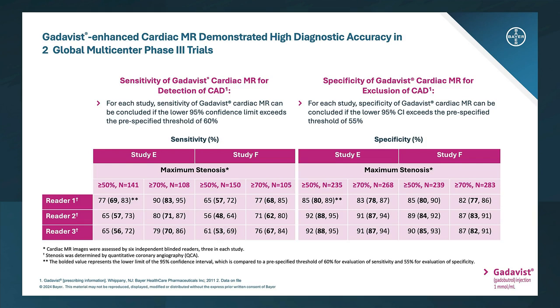The left ventricular myocardium was divided into 6 regions. Interpretations were provided per region for cardiac MRI, reporting presence or absence of perfusion defect and/or LGE, while QCA results showing presence or absence of stenosis of greater than or equal to 50% or greater than or equal to 70% were provided per artery.